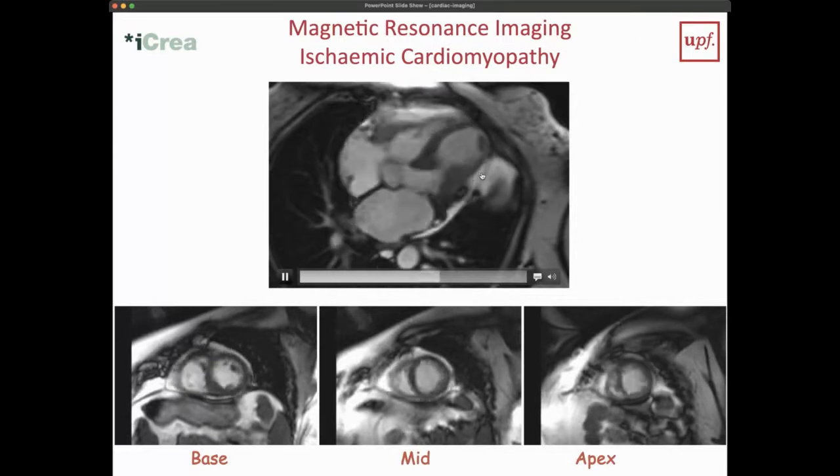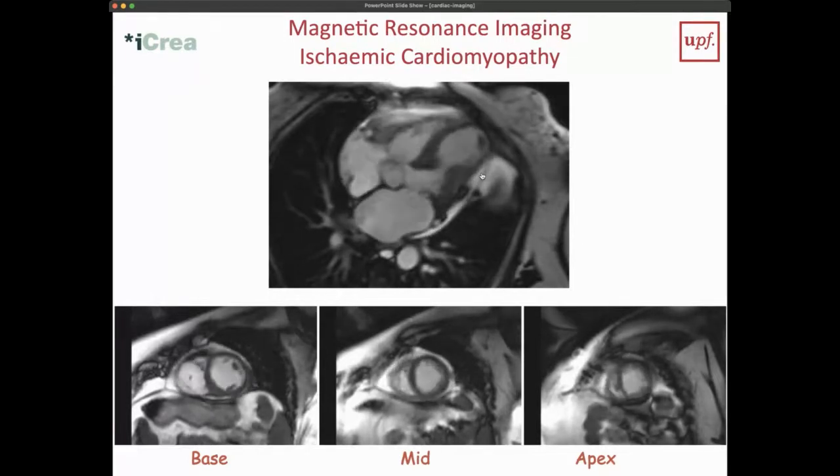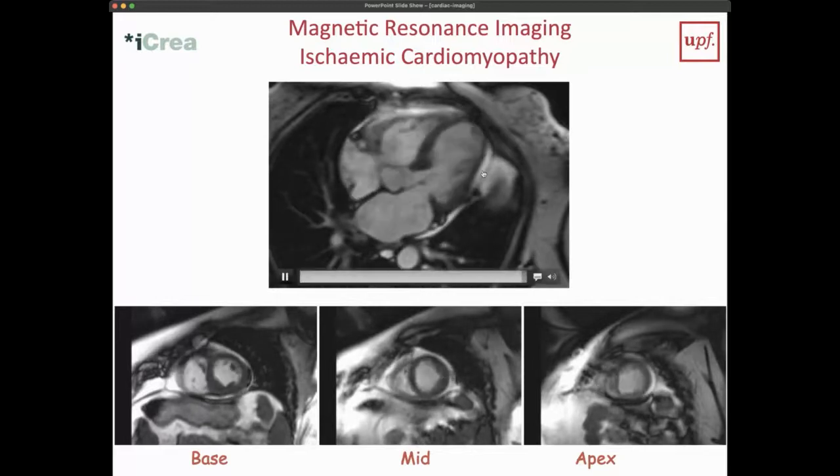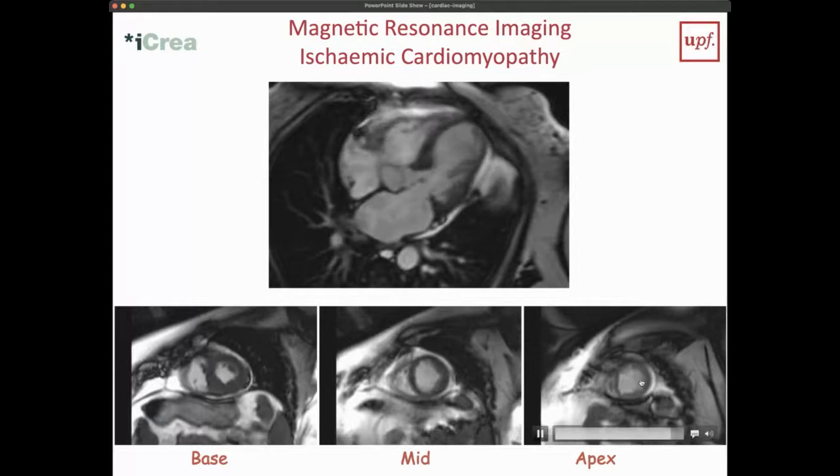Normally you have this liquid because, what I told you before, you have the sac around the heart and the heart can freely move there. So of course this needs to be frictionless. So you have a very little bit of fluid in a normal heart there. But if you start to get big abnormalities, you start to see an accumulation of fluid. And if you have really a lot of fluid, it actually also becomes problematic. You see here nicely how this apex is wiggling within this heart in between this fluid.